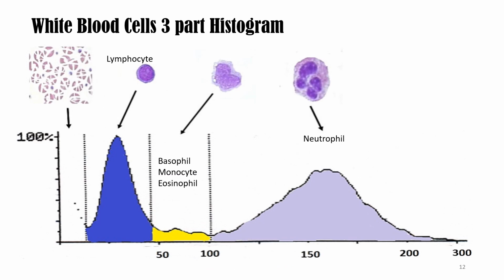So if you look into this white blood cell, again, remember, histogram is what the machine is going to report. So what is the histogram, or what is the machine actually looking for? The size, the width, the length, in order for them to call it either white blood cells or red blood cells and platelets.